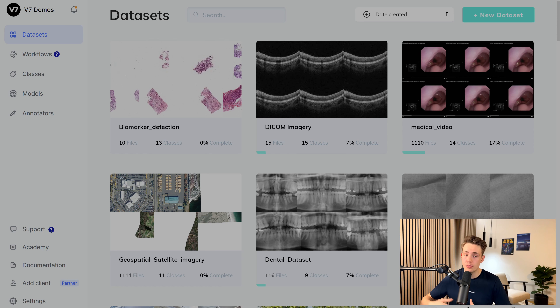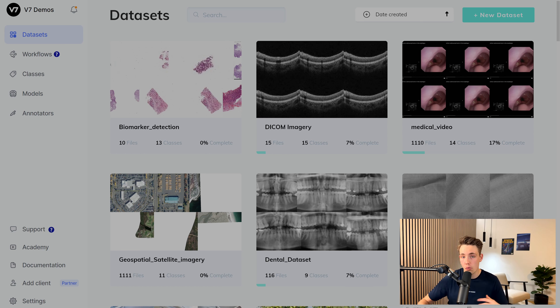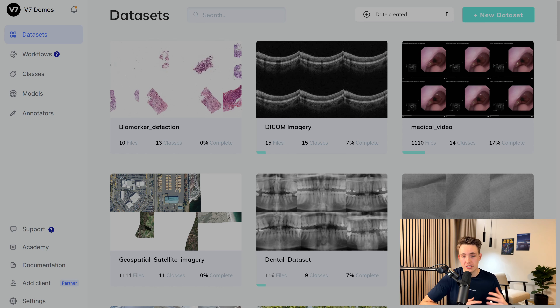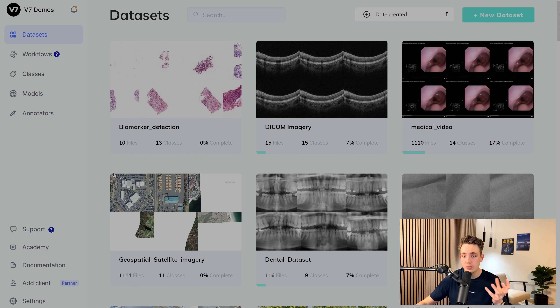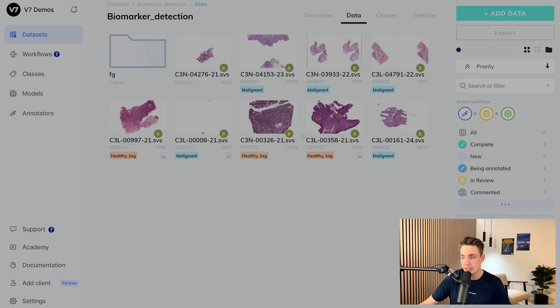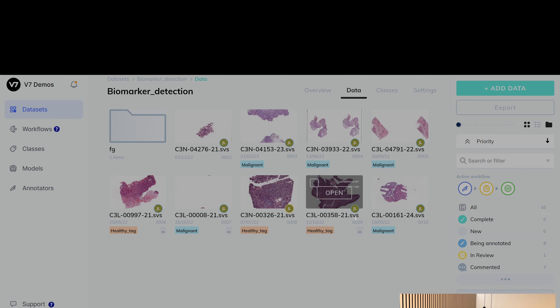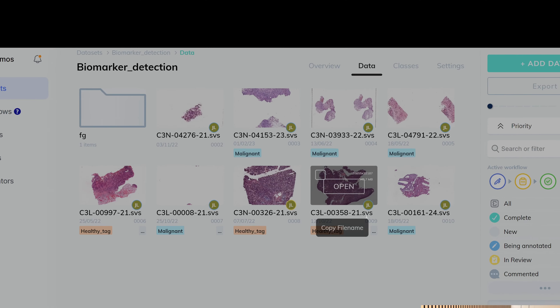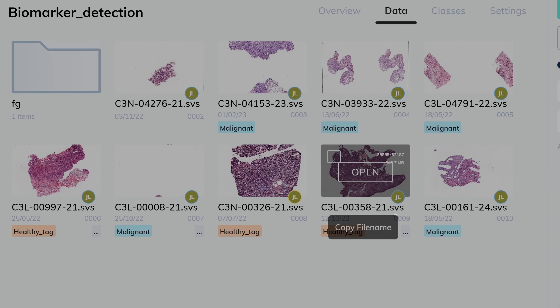I've jumped straight into V7 and I'm going to show you how we can auto-annotate our whole slide imaging. We're going to use this for doing detection of different cells, like cancer cells and cells in general. Here we have the different datasets. I'll go into the biomarker datasets to start with, and we can see we have these SVS files, which is basically what V7 uses for loading in our WSI files.